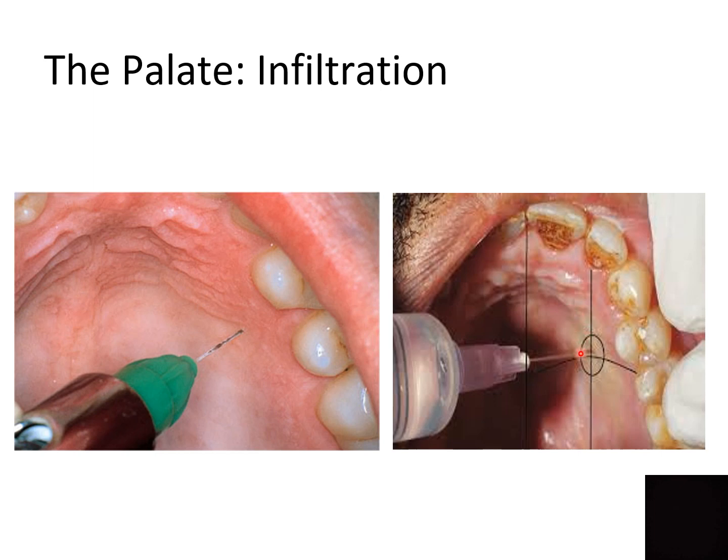And as soon as you see the palatal tissues blanch, and you can clearly see the pale white color of the palatal tissues due to vasoconstriction caused by adrenaline in the local anesthetic drugs we use commonly, that's when you need to stop, because excess of vasoconstrictor in the palatal tissues can cause severe compromise of the blood supply to the palate and result in ischemic necrosis of the palate.